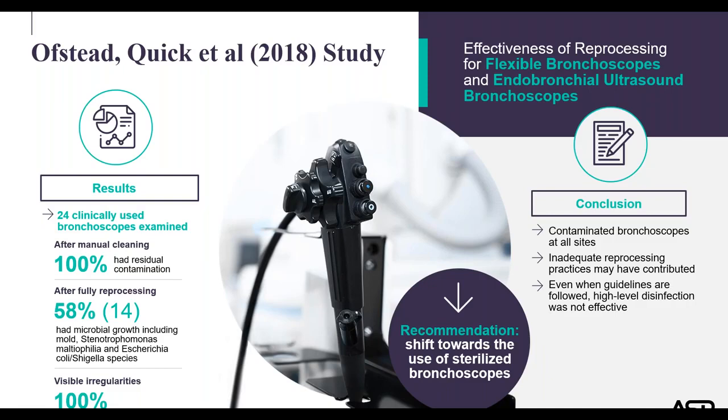And I just want all of you to think back to some of the previous slides and the information that we've shared with you, the recommendation from AORN, as well as AAMI, and the fact that many devices may be validated for more than one processing method, meaning both high-level disinfection and sterilization. It is always best practice to know what the IFU states for a device, and based on your own department's risk assessments, make well-informed and evidence-based decisions.